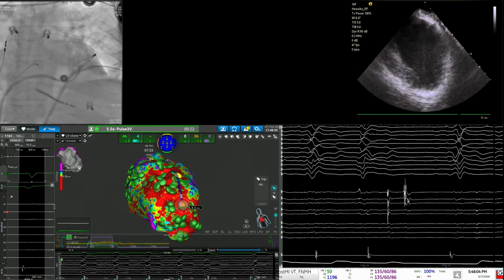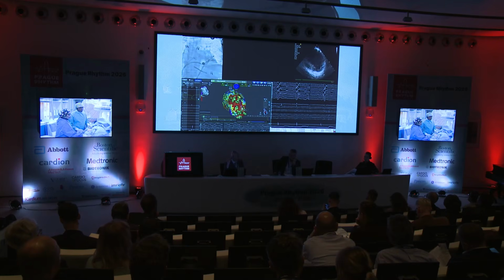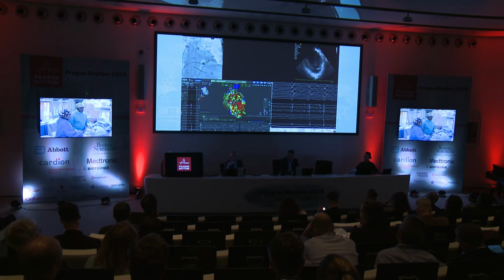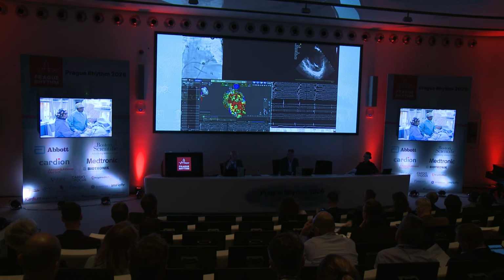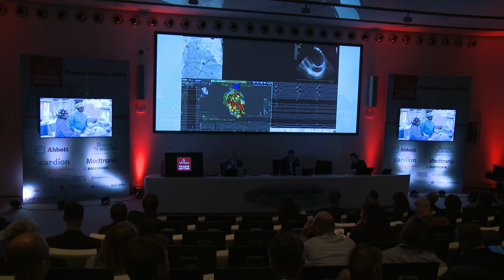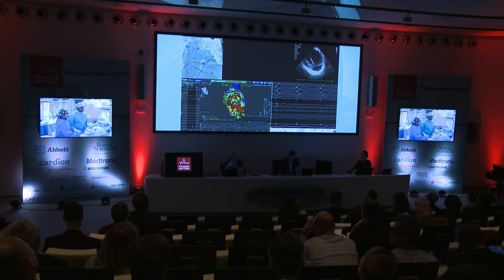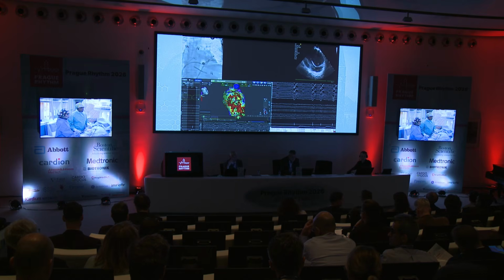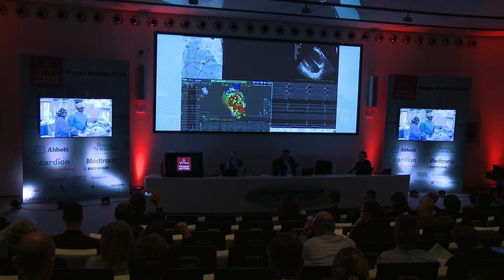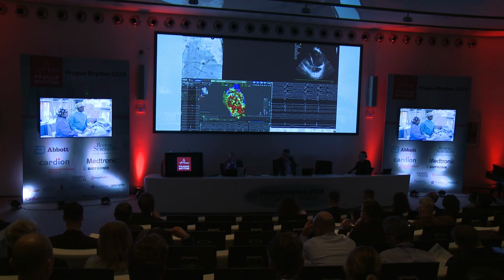Vivek and Devi, we get a signal. We have to slowly conclude this case because we have to go and wrap up another 2 cases. Obviously, it was an extensive scar. I think you made a good choice to do that homogenization of the septum. The way that the fast VT initiated, based on EGMs from the ICD, I think was typical for some septal reentry and then spiral wave breaking and going to VF. So I think you're doing a good job for the patient.